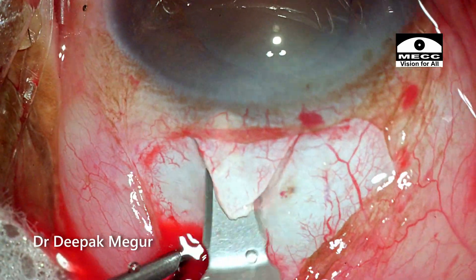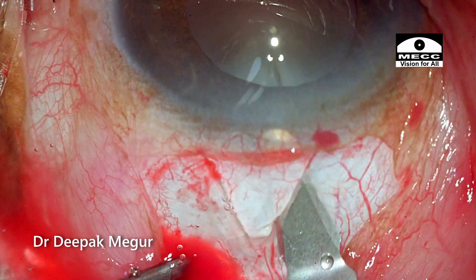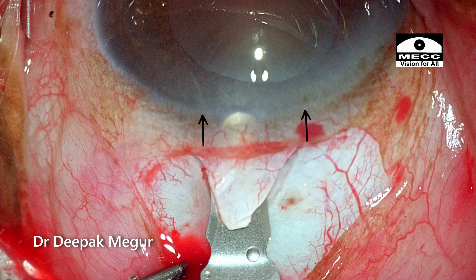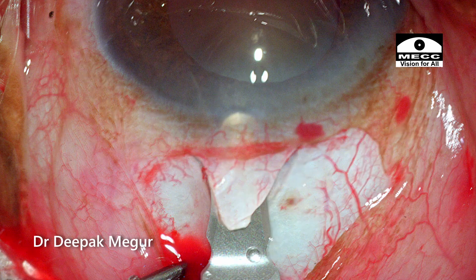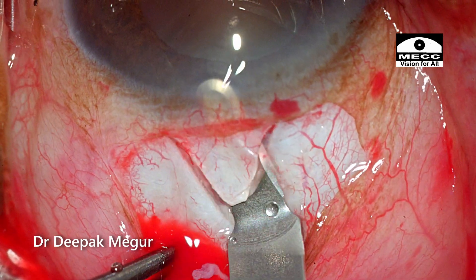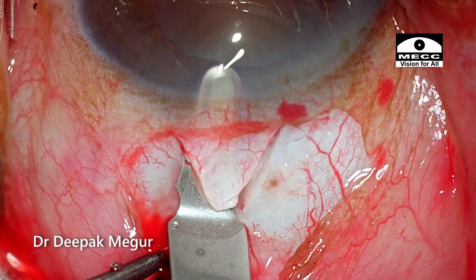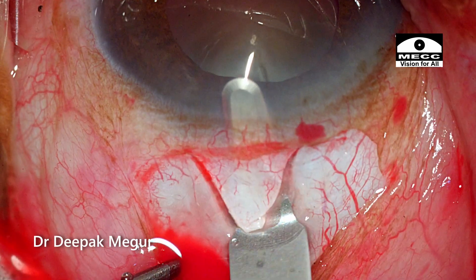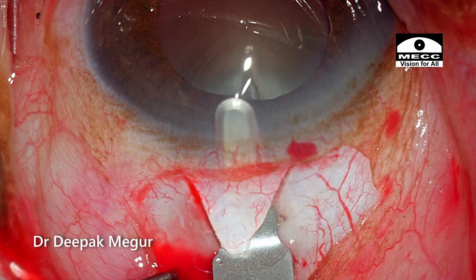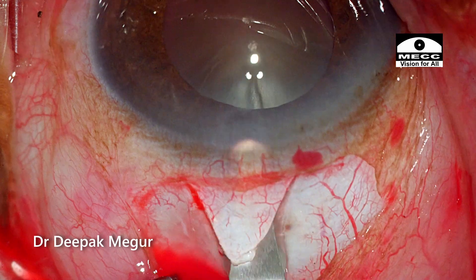As I'm tunneling towards the limbus area, there are two different endpoints for creating a tunnel. The first endpoint stops at the limbus. The second endpoint is going to be about two millimeters inside the limbus — a very small central area not more than two millimeters in width, ending approximately two millimeters beyond the limbus. This is where I stop.